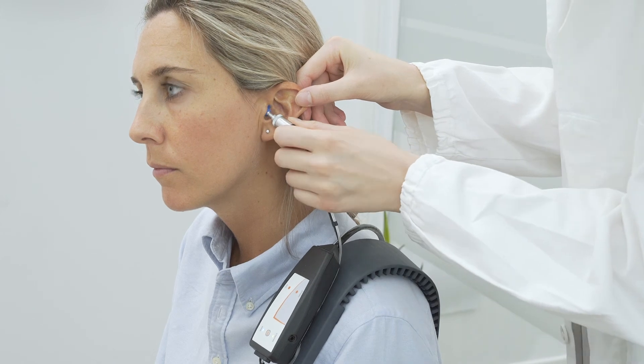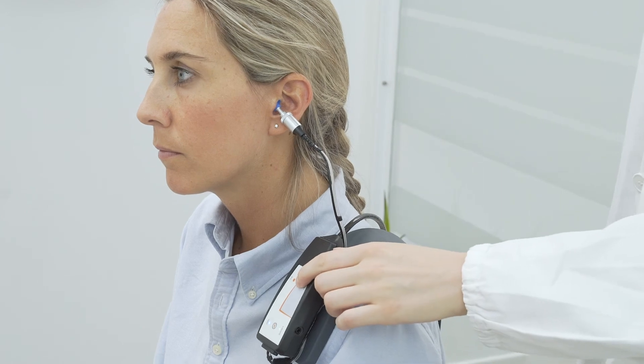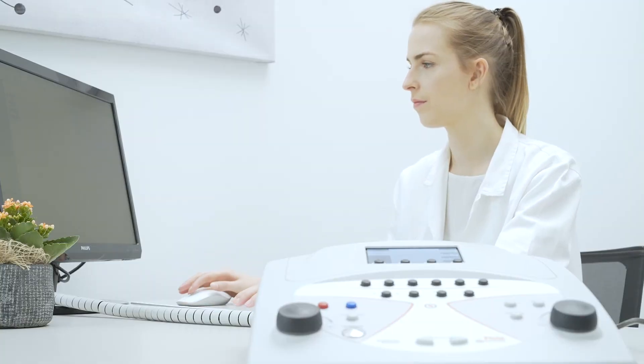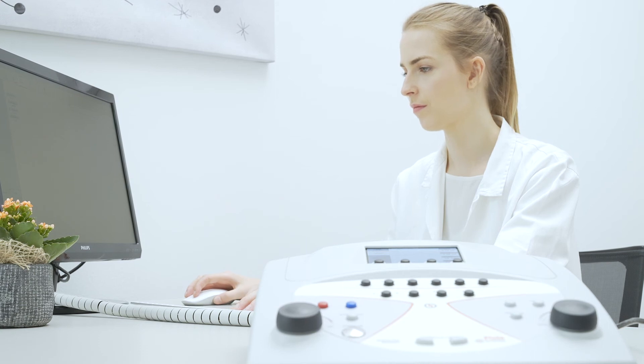The probe is extremely light, small, and made of metal. It maximizes the patient's comfort and can be easily disassembled and cleaned. Simply connect Flute to a USB port on your computer and you can transfer exam results directly onto your Maestro or NOAA database.